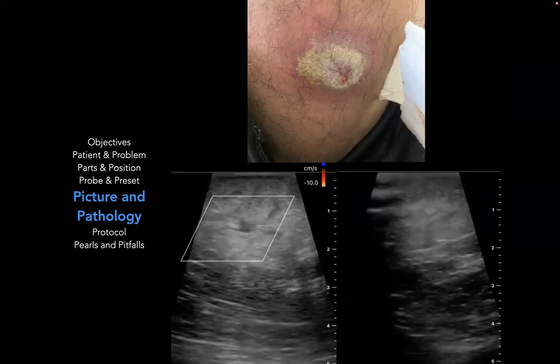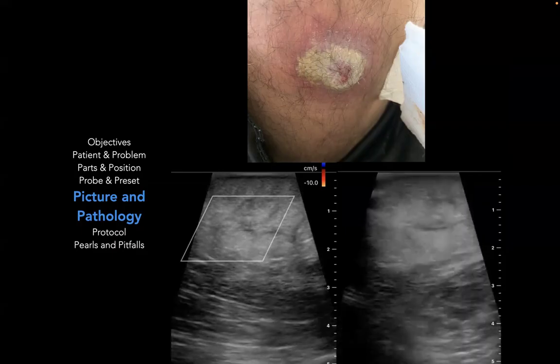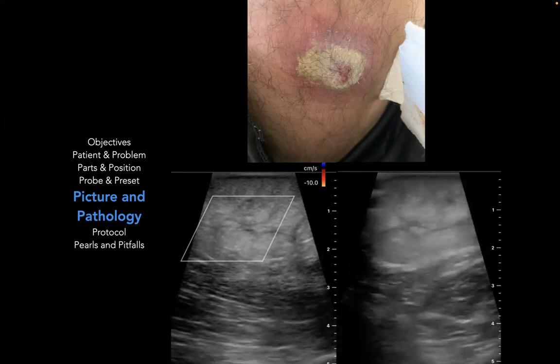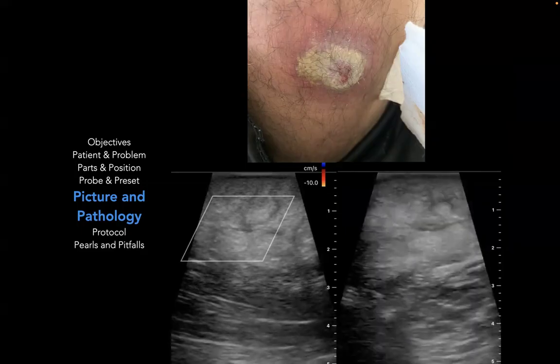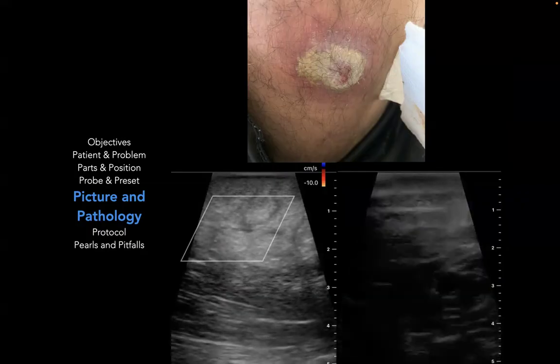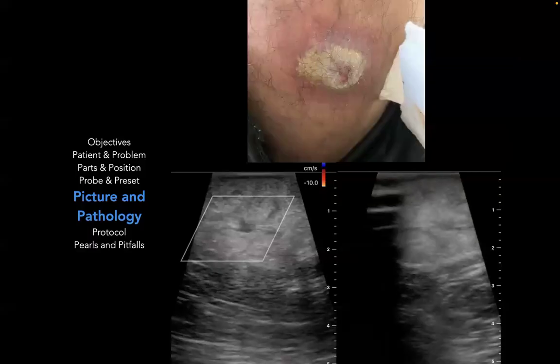So this is one of the reasons why I do soft tissue ultrasounds in all patients that present with skin and soft tissue infections, because there are always those equivocal cases. And even in cases that seem 100% abscess by clinical exam, it may sway you when you use the ultrasound.